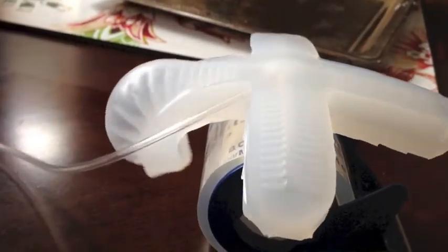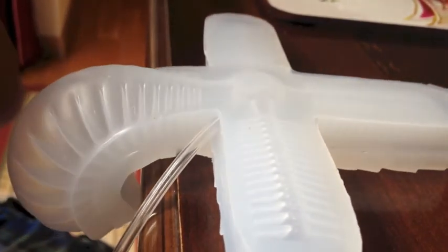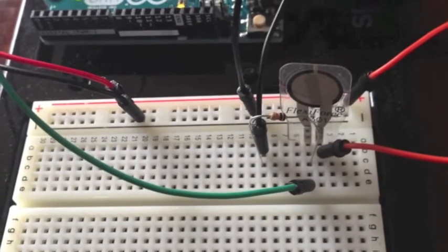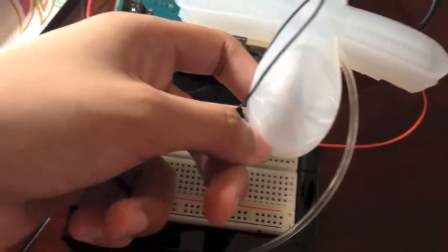We used 3 different sensors with the Arduino setup. They were temperature, pressure, and flex. For our testing, we compared the normal hand motion to that of the soft robot gripper using the 3 sensors of temperature, pressure, and flex.